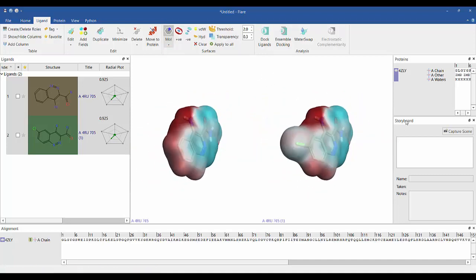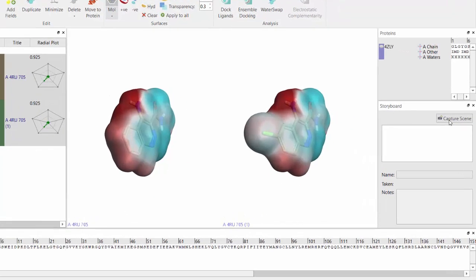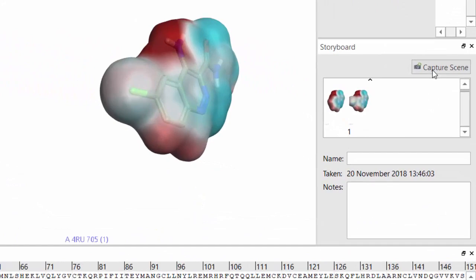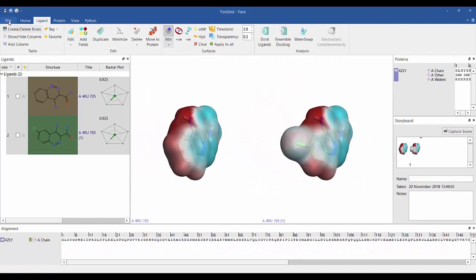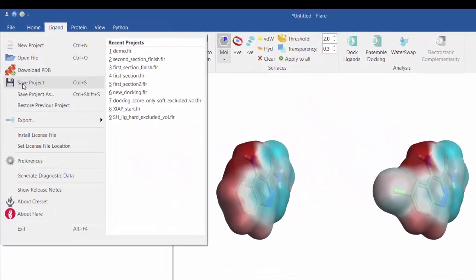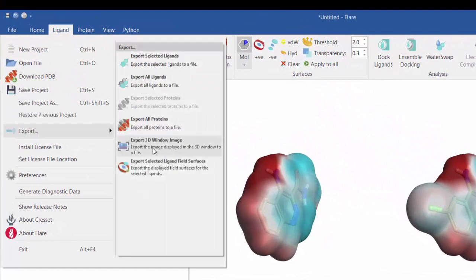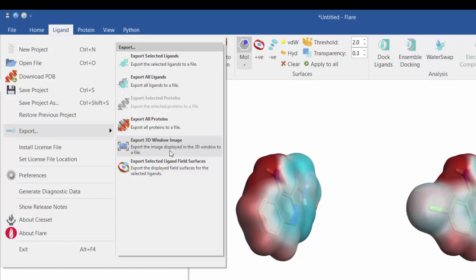Important scenes can be captured and annotated and can be recalled when needed. Images can be easily copied and exported from Flare Viewer with many options to configure the image or file size.